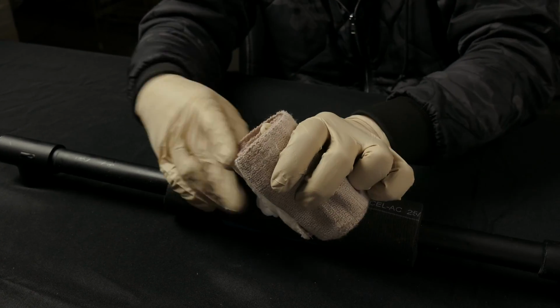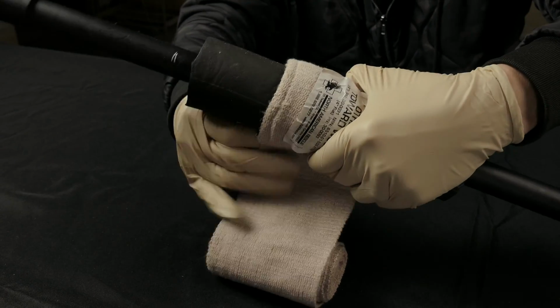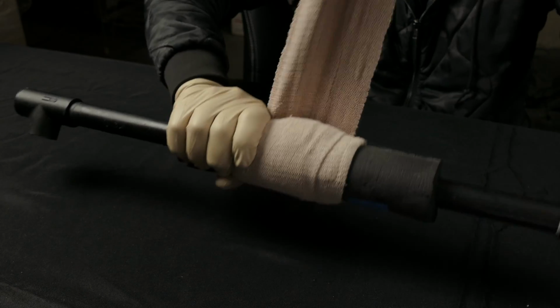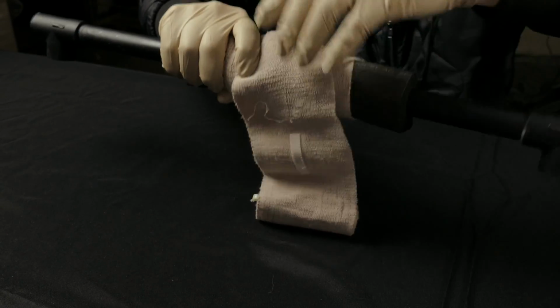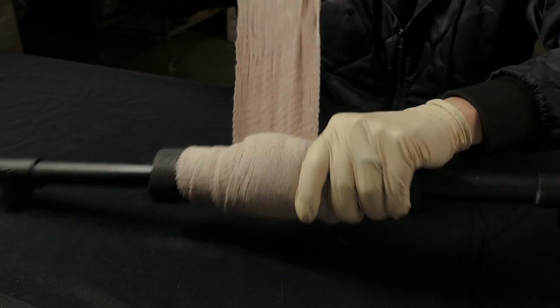Now I'm going to apply this. So the ETD has this pad right here in the middle. I'm going to put this pad directly on top of where all that gauze is. Now my first wrap is really just going to stabilize this in place. I don't have a ton of pressure necessarily with my first wrap. Put that on, and then each subsequent wrap is going to get tighter and tighter so that I can maintain that pressure on the wound. No need to cut this, just keep wrapping. You're not going to put too much pressure on here.